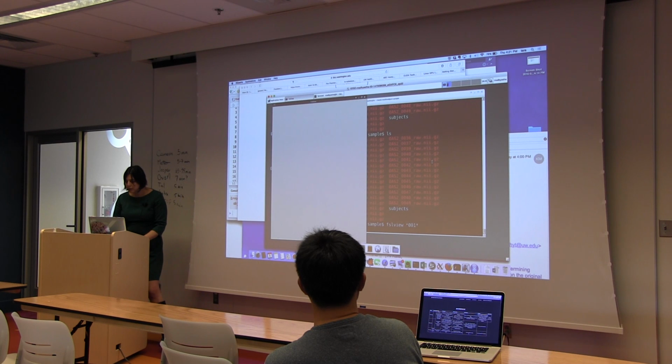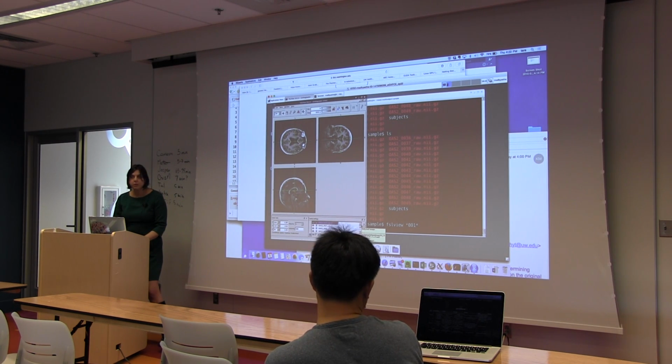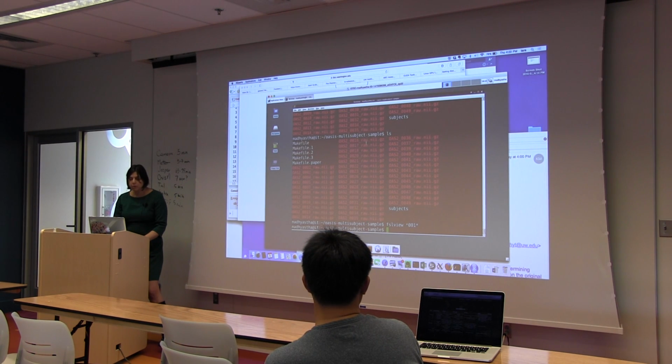I will see that it is not oriented according to FSL's conventions. If it loads. Please load. So I'm going to need to reorient these first. Otherwise skull stripping will fail pretty miserably. That was one of the first things I discovered about neuroimaging. So that's the first thing that we have to do, and then we have to run that.